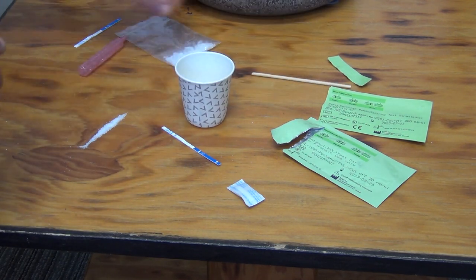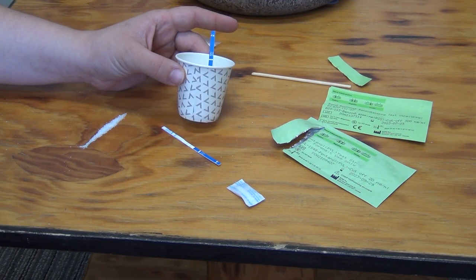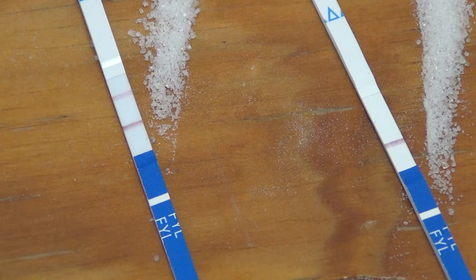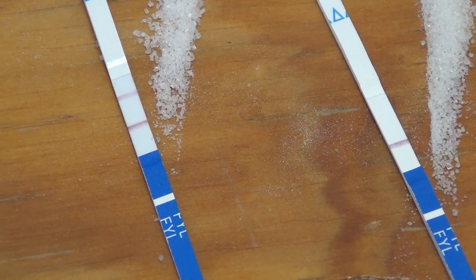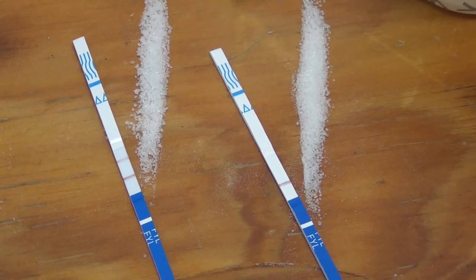There are a few things to be aware of. First, just because a strip comes back with a negative result does not mean that there is none of that substance throughout the entire supply you pulled your sample from. There could be trace or large amounts of that substance elsewhere in the supply. Be cautious.